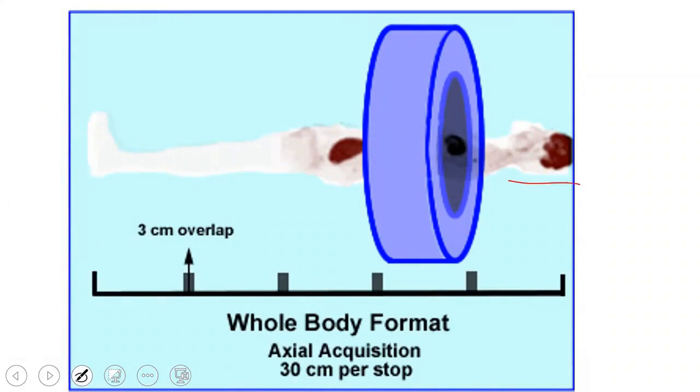This field of view is oriented towards the patient, meaning it has a certain width and a specific field of view in that direction. So, when imaging the patient, for example, the whole body is captured from the head to the upper knee or just after the mid-femur.